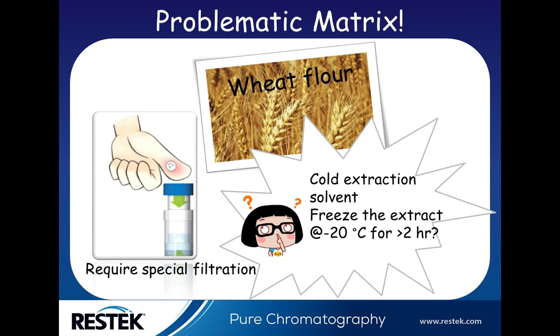But when I was preparing this presentation, I was thinking that maybe in the future, if I come back to do this work again, I can try a cold extraction solvent and freeze the samples at a lower temperature for a longer time.